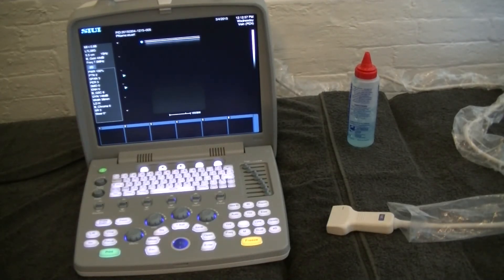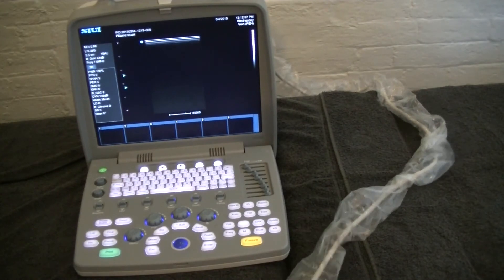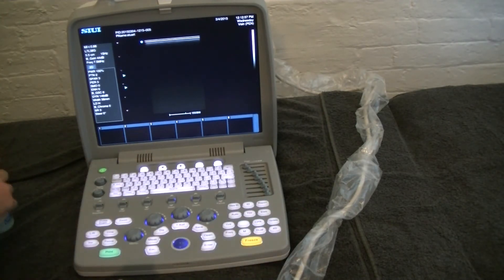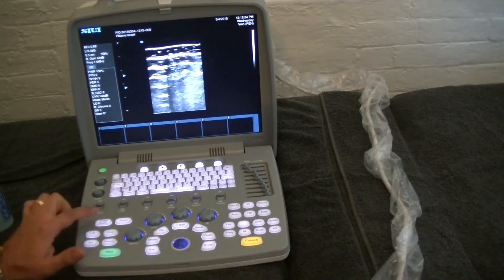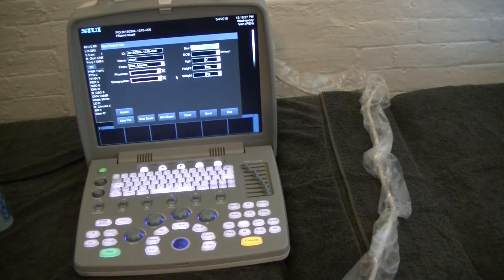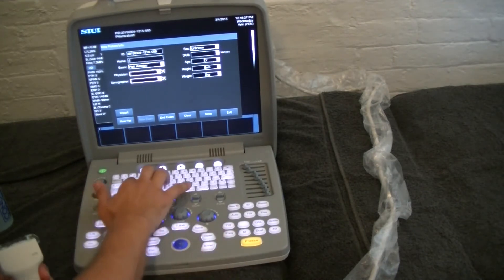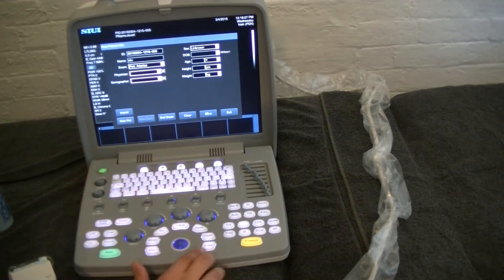Let's go through the process of optimising an image with our linear probe. We'll have a quick look at the patellar tendon. We'll put some gel on the probe and take it off freeze so we can see what's going on. The first thing I'm going to do is hit ID so I can save these images to a patient file. We're going to enter a new patient — I'm just going to put the first name in only, although you can put a whole bunch of other information if you'd like.